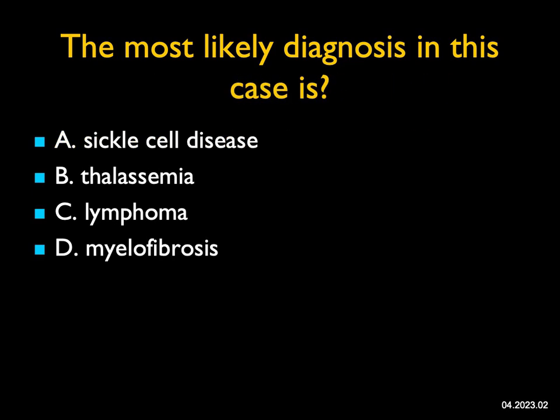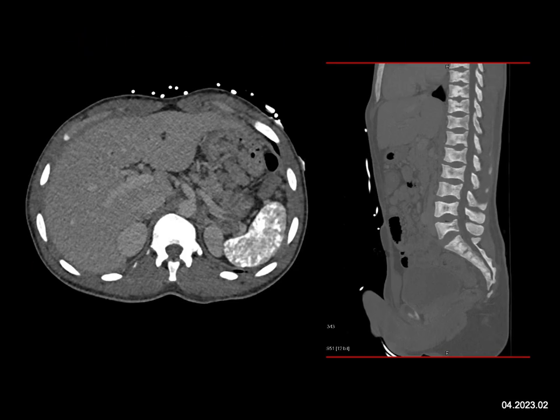The most likely diagnosis in this next case — on the axial images the most impressive thing is the calcification in the spleen. The spleen is small, and this is best described as auto-infarction. Auto-infarction can occur after prior trauma in theory, but typically it's just a small spleen with some rim enhancement, or a bigger spleen with calcification.